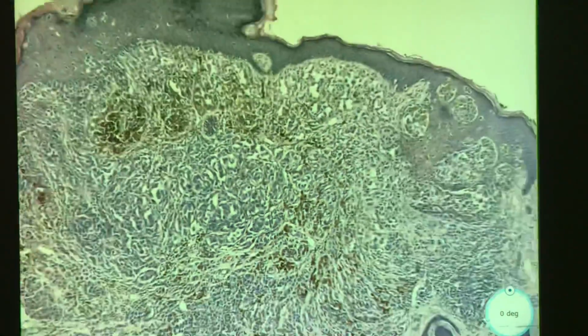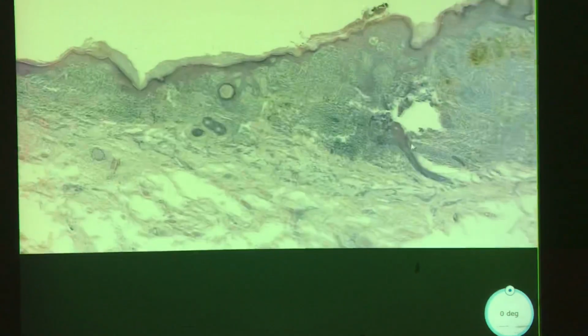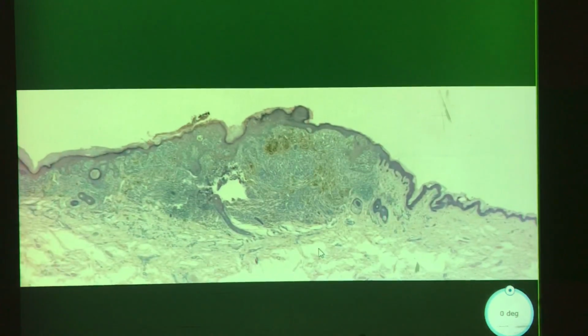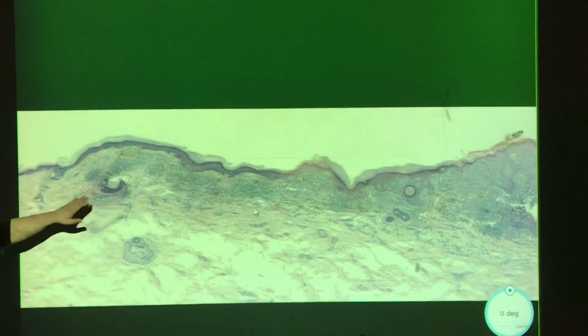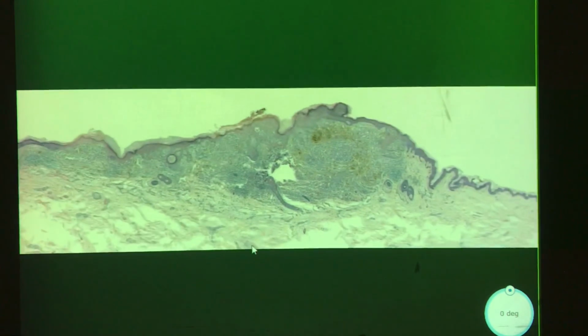Yeah. So it's invasive melanoma because it's going to the dermis, but it's not going in too deep. Is this like a superficial spread? Yes, that is exactly what this is. All right then, let's leave it at that. And if you go more towards this side of the slide, you can see how it kind of keeps going for a good while. So that also helps you out a little bit if you're struggling looking at this. But yes, this is malignant melanoma, superficial spreading type.